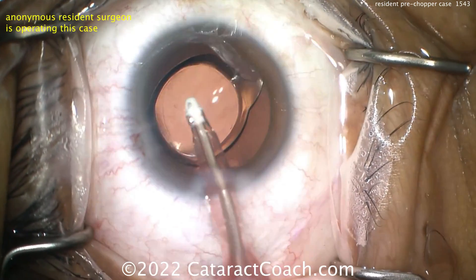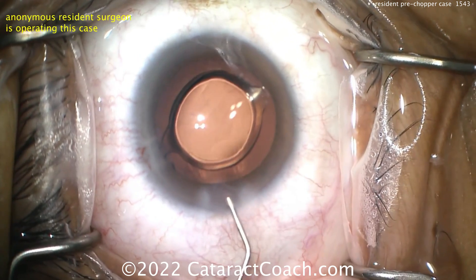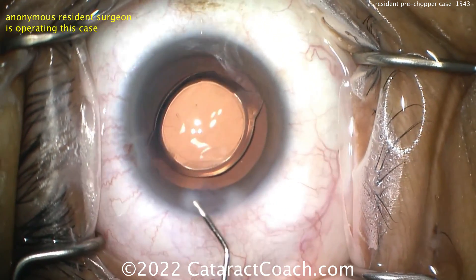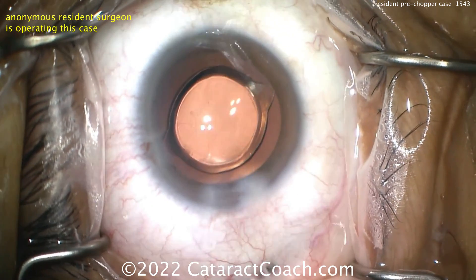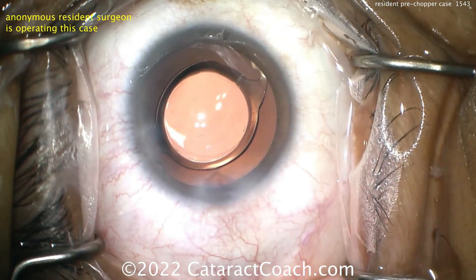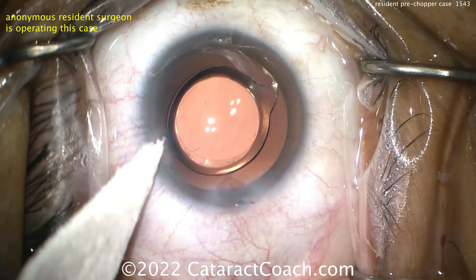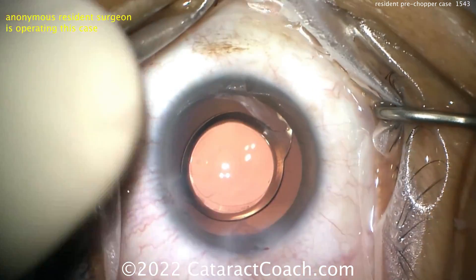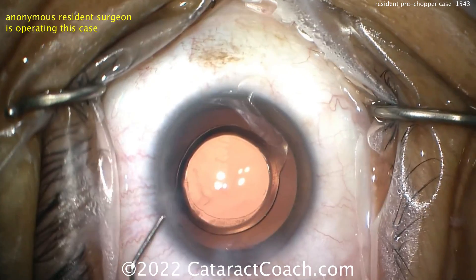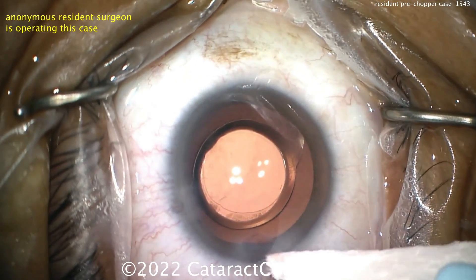Now taking out our viscoelastic. The CCC size is pretty reasonable — maybe a little less than five millimeters — so that lens has roughly a five-millimeter focusing optic, maybe 5.1 or 5.2. It looks great. Pre-chopping definitely works well and you should try it in your armamentarium. Maybe some of you will continue to use it thereafter.